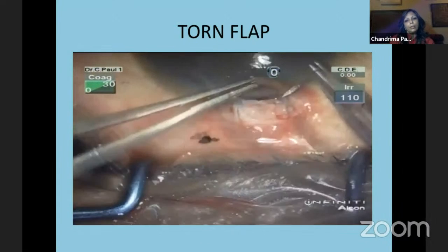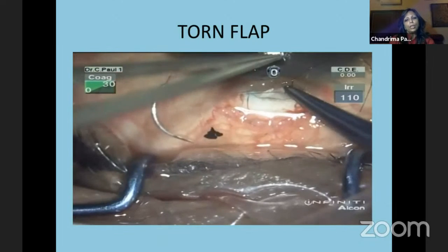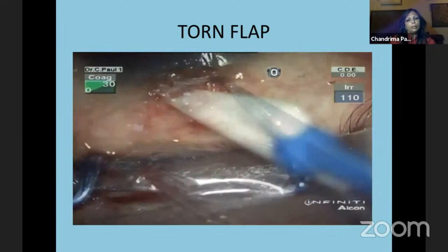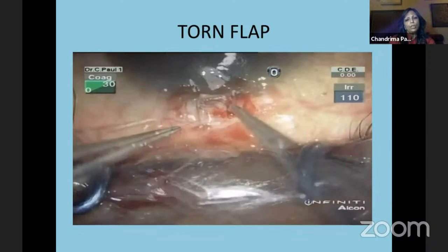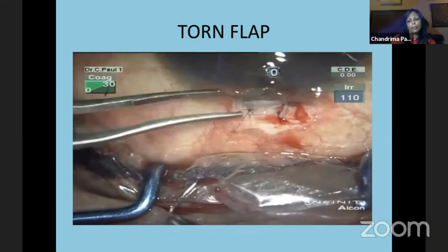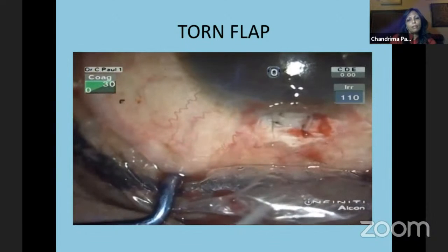That's how you place it right where it should be, and suture the flap back so that it creates the normal scleral flap that we want in trabeculectomy. Once you've done that, it's fine, and there is no need to panic. But when it does happen, you do get panicky. The flap is sutured back, and it's almost as good as a normal scleral flap.